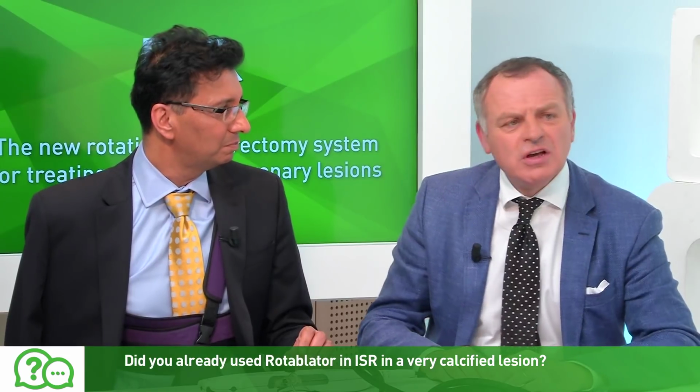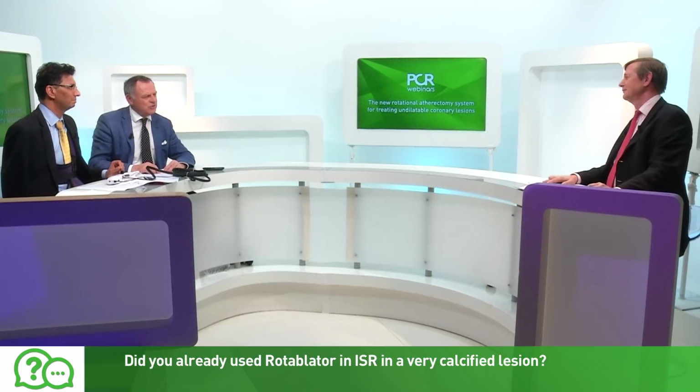Any thoughts? There was the ARTIST trial, which was rather disappointing, but is it something you would ever use? Personally, I don't use rotational atherectomy to treat in-stent restenosis. So for me, it's not an ideal situation. No? Okay. I would agree.